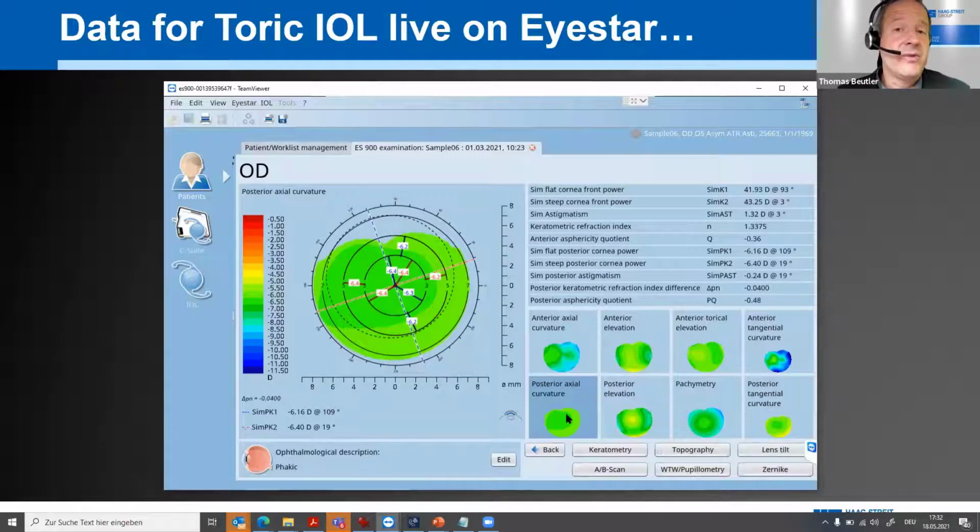So if we again would use the standard nomograms, which is basically half a diopter against-the-rule astigmatism, which would here be corrected, then we will get a wrong result. Not by a lot, but it could be the little tweak on the balance to have a perfect outcome, or an outcome which is just close to perfect and might lose one line in the visual acuity in the end.